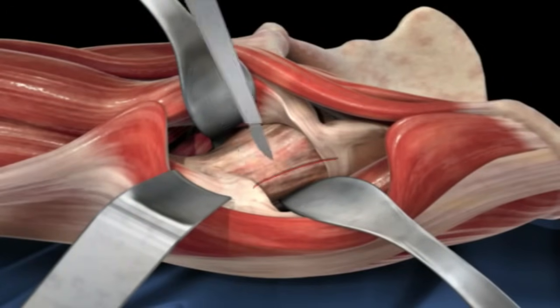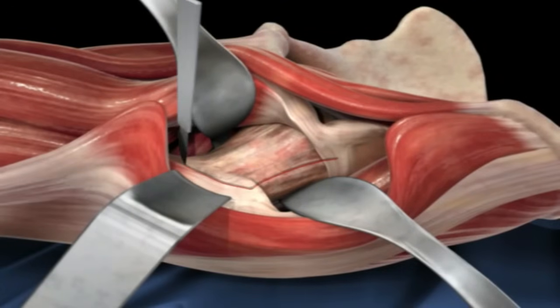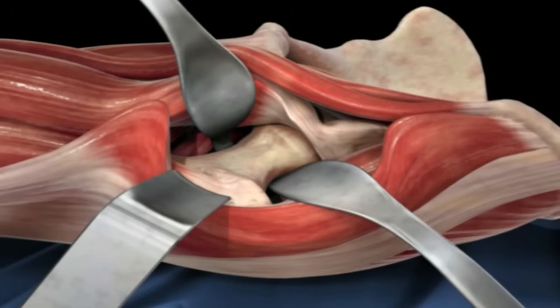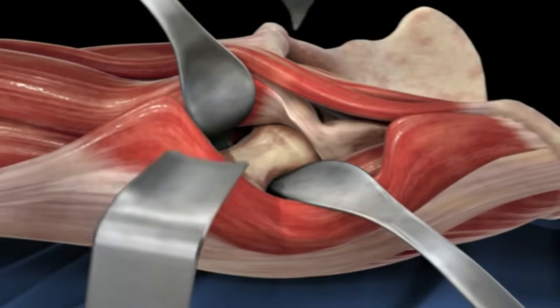The scalpel here is incising the hip capsule, which is a thick fibrous tissue layer that surrounds the hip joint and seals it off from the surrounding structures. Once that hip capsule is open, the ball and socket joint can be seen very well.